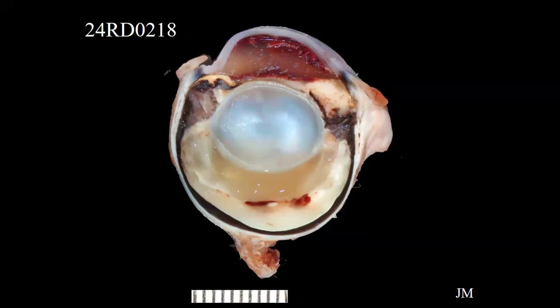So grossly, here we've got the eye of our cat. Our cornea is up at the top. The anterior chamber has got this gel and hemorrhage in it. We can see an iris leaflet over here. Then this one over here starts to look a little thickened and irregular. We also noted that there was a little scleral bulge dorsomedially in this globe. So we cut it a little bit obliquely to get this little bulgy area here. It's a little bit thickened.